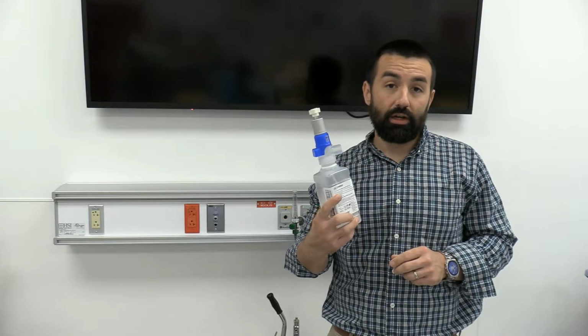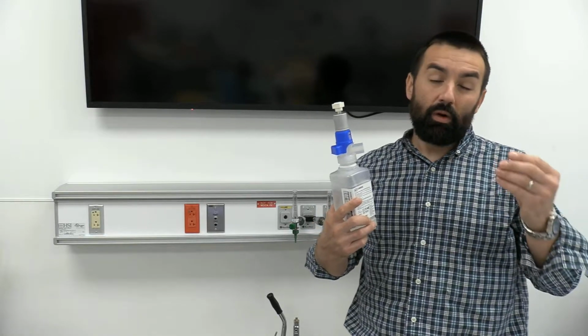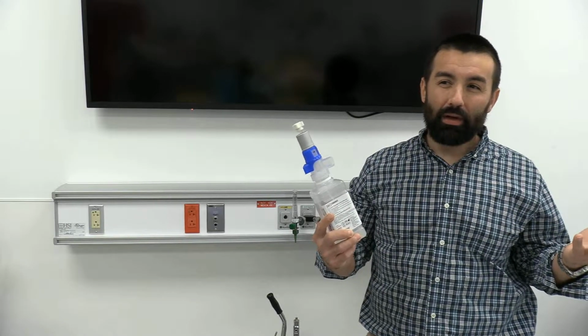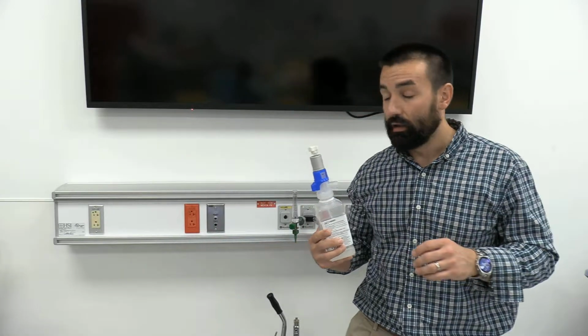Okay, so humidity, like with the bubblers, is invisible. It's water vapor, right? We can't see it. Now with aerosols, which is what a large volume nebulizer actually is creating, not that there's not humidity involved in the process, an aerosol is actually water particles suspended in a gas. So the idea with bland aerosol therapy, meaning non-medicated, is we are ultimately blanketing the airways with an aerosol of sterile water for inhalation. These patients are getting moisture down into their tracheobronchial tree to keep secretions moving, make sure everything's nice and moist, and preserve the function of the lower airways.